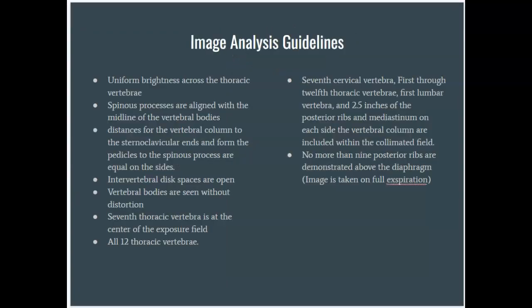The next slide just gives you an overview of the image analysis guidelines that I provided for you. Again, we know that these image analysis guidelines are a little bit more extensive than what Merrill's provides you, but this is to help you be able to adequately critique your images. These are just little tips and tricks to help you. Please don't spend time committing all this information to memory, but use it as a guide.